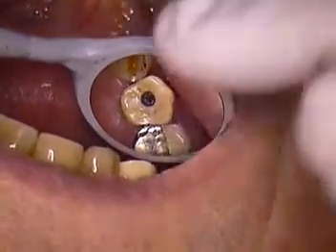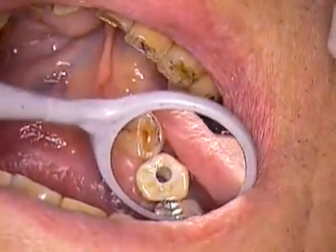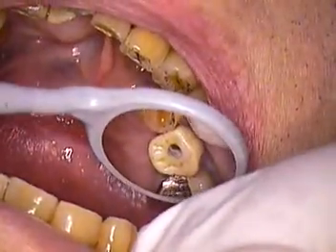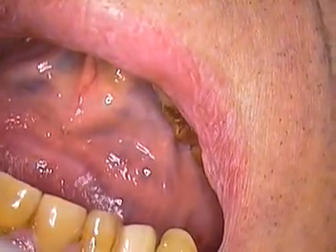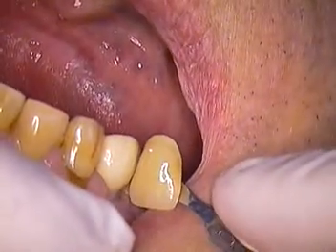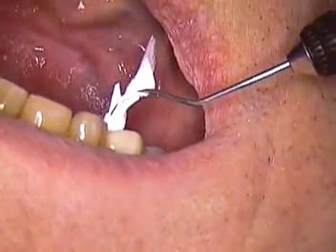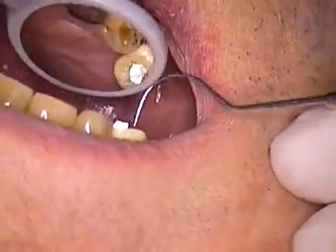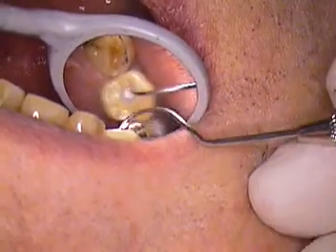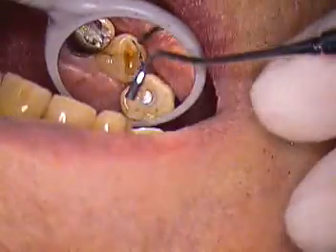He's already chewing. So we're going to put some Teflon tape down in there, also known as plumber's tape. Believe it or not. Just looking at our color — that's our C4, but we did get it back a little bit lighter than C4. Here comes the Teflon — just push that in place, and that covers the screw head nicely for us.